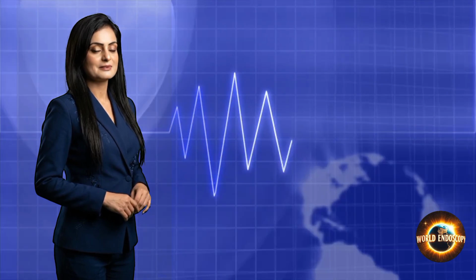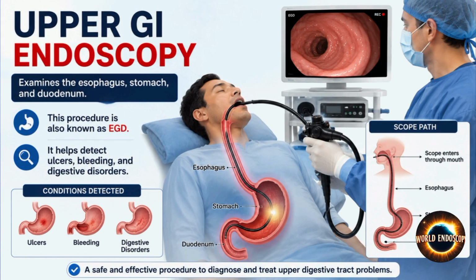Upper GI endoscopy examines the esophagus, stomach, and duodenum. This procedure is also known as EGD. It helps detect ulcers, bleeding, and digestive disorders.